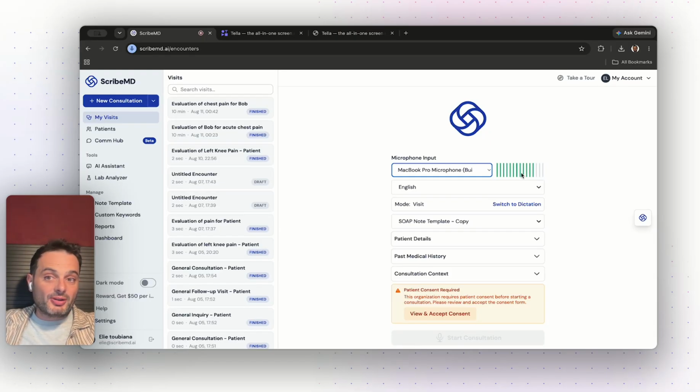So what I would definitely recommend if you don't have a microphone is to buy a microphone. You can look up online for ambient microphones so that it can also capture what your patient is saying. And also, in general, when you use your phone, I say that you should be 6 to 8 feet at most to anyone speaking. So in case you're using a laptop or you have a computer in the room, just make sure that the patient is not too far away from the computer. Get the computer closer to the patient if possible.